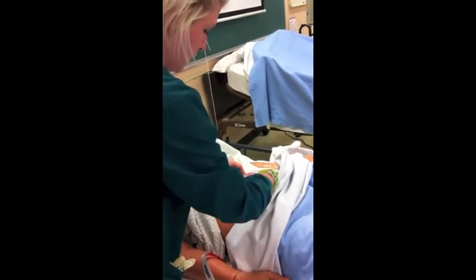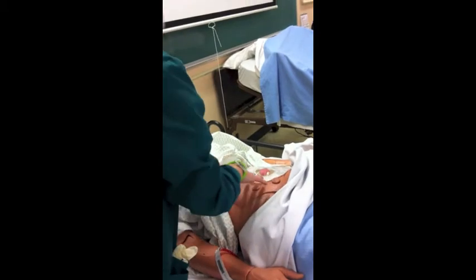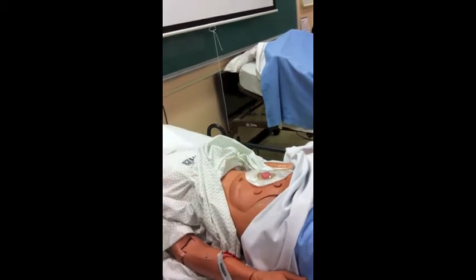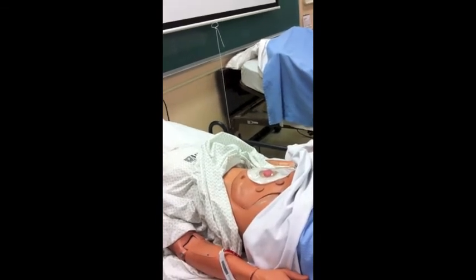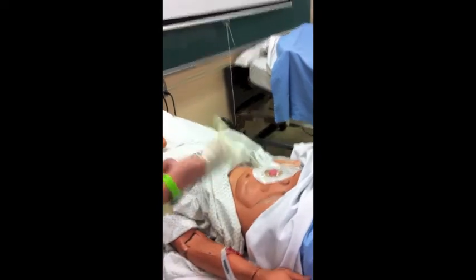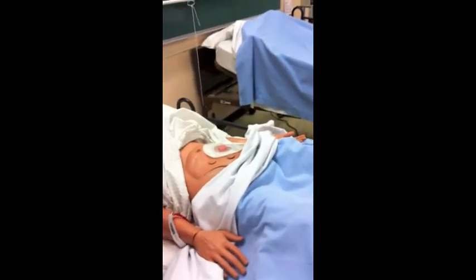Next, I'm letting her know what I'm going to do. She's in a good position for this. So first, what I'm going to do is put on gloves to remove the old bag. I've provided my patient as much privacy as possible.